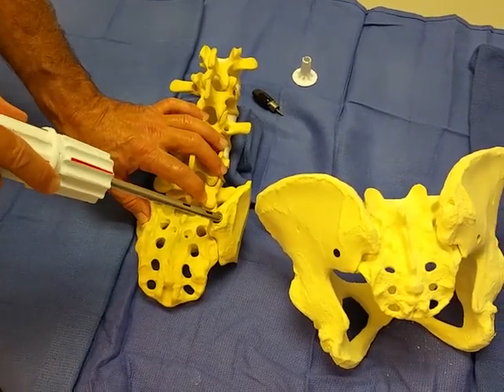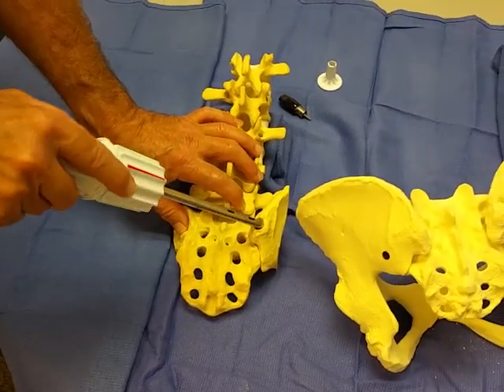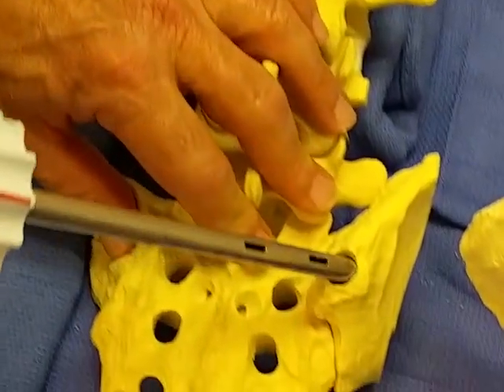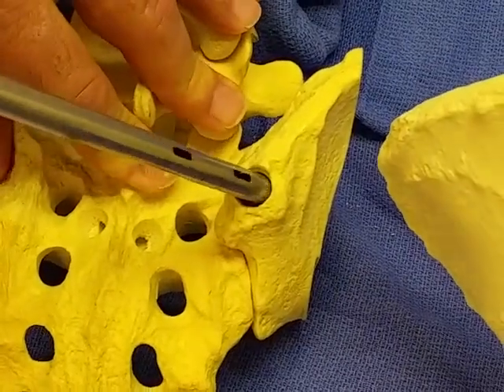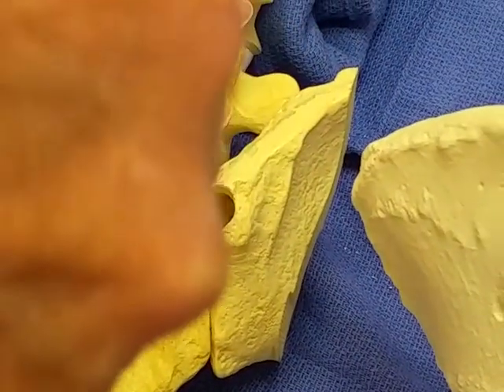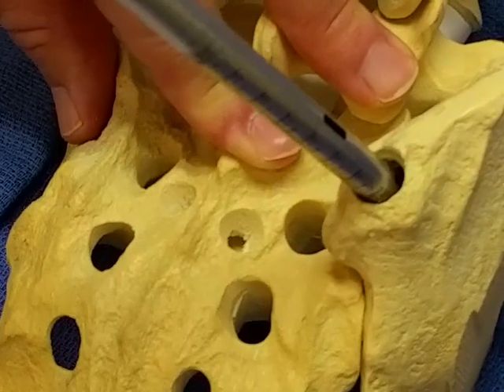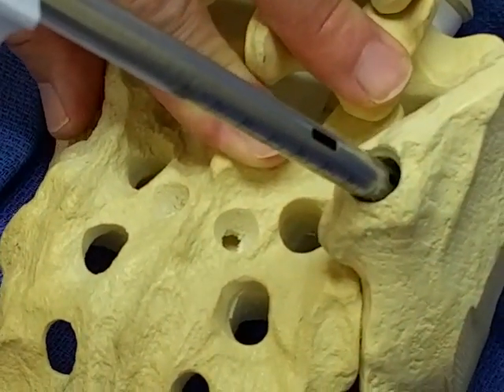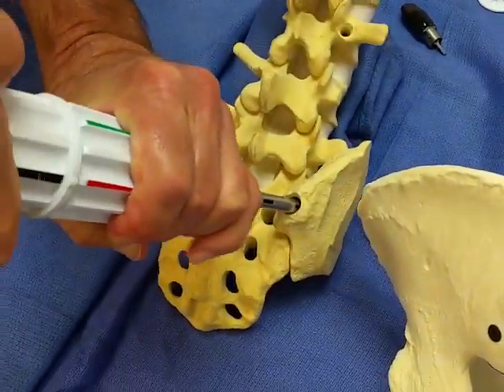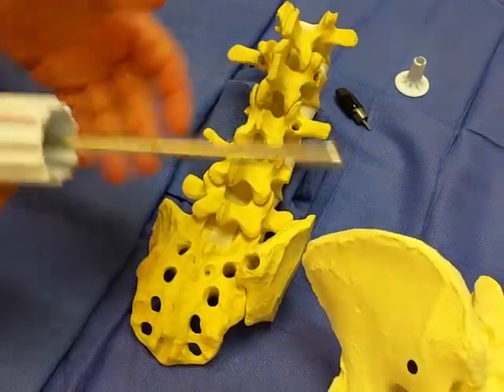The Corex can also be used like a forward curette — by placing the beveled surface against the edge of the outer and/or inner table and pushing it to peel the cancellous bone, feeling it as you glide along the table. Once you've collected enough inside, rotate from green to red fully, withdraw, and deliver the fragments of bone. And that's essentially it. Thank you.